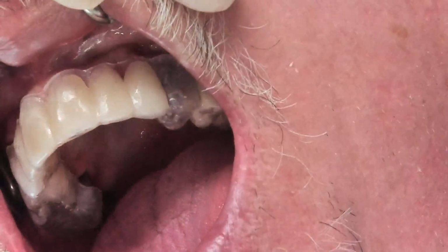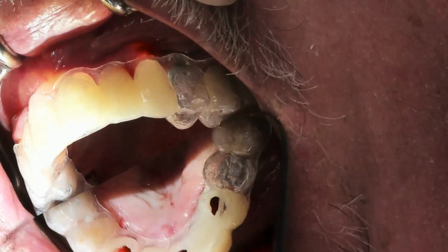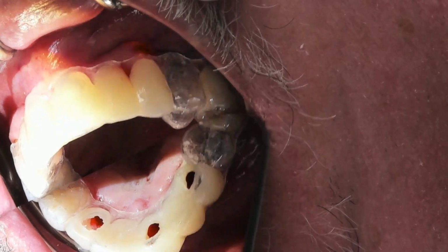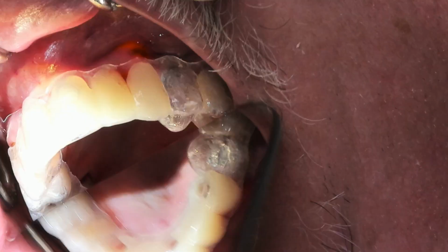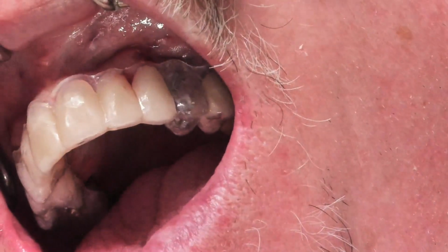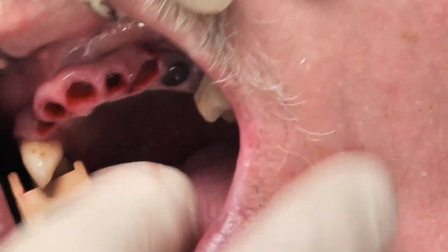So now I'm going to put this in like this. I don't know if they could see this or not, but you can see the initial sites of where we are. I don't know if you're going to be able to see the site marking until I go a little bit more. But this is why zirconia implants.